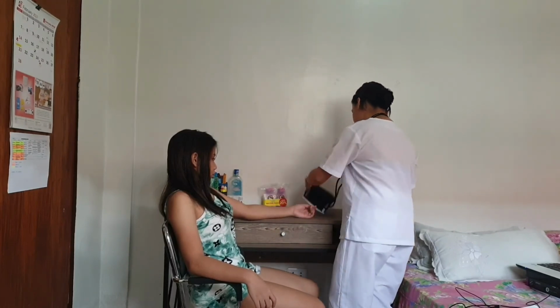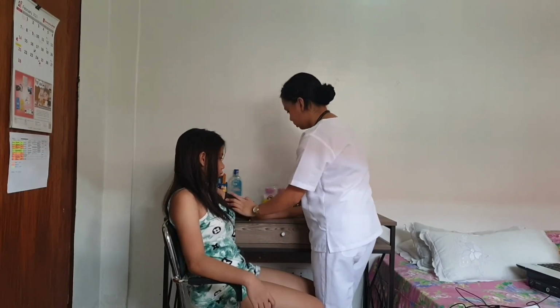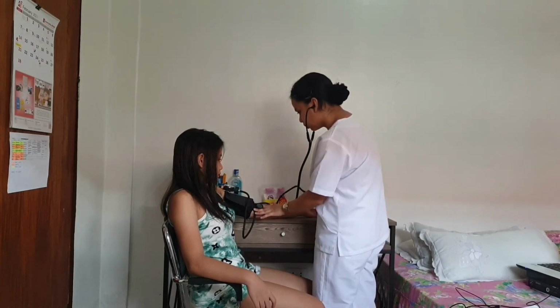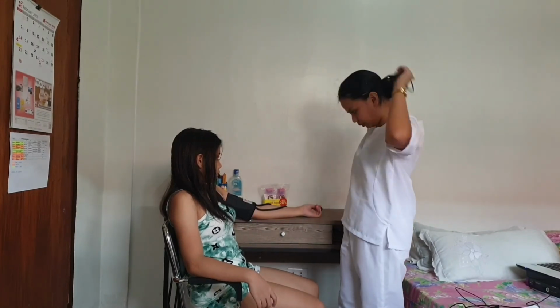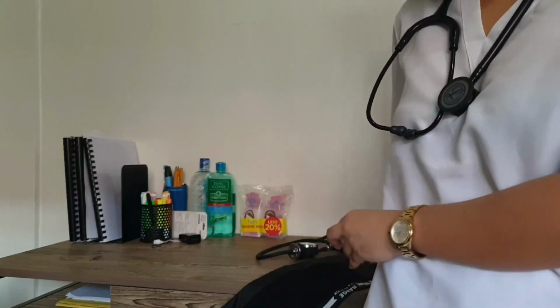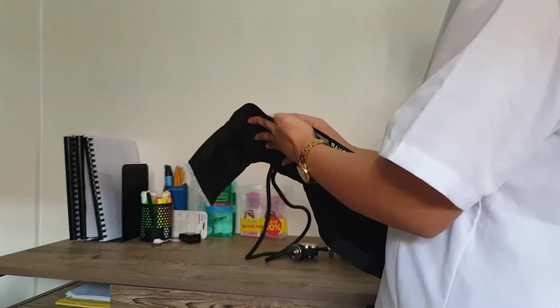Okay. It is 90/70. I'm just going to disinfect my cuff with an alcohol swab so that it will be safe for the next patient that will use this.